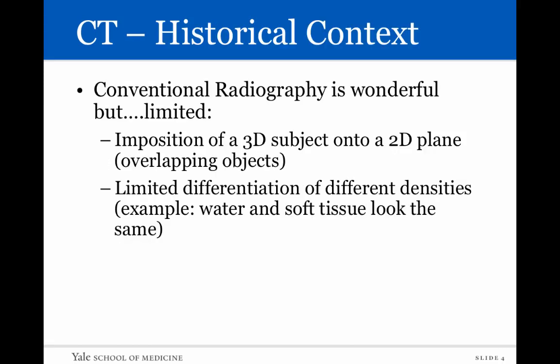Conventional radiography is wonderful, however, it has some limitations, first of which arises from this concept that you're basically trying to impose a 3D subject onto a 2D plane. Many objects will overlap each other, you won't be able to tell them apart on conventional radiography. And there's also limited differentiation of different densities. We can really only differentiate 5 basic densities on conventional radiography, where things like water and soft tissue actually look the same, so you cannot differentiate them apart.